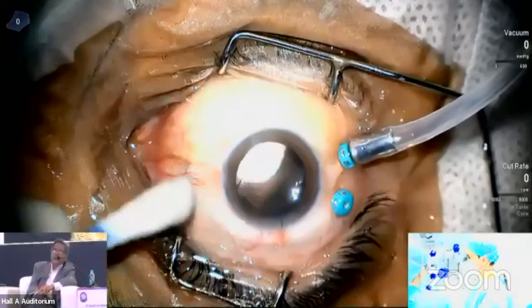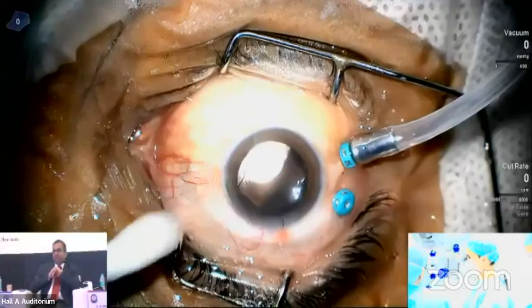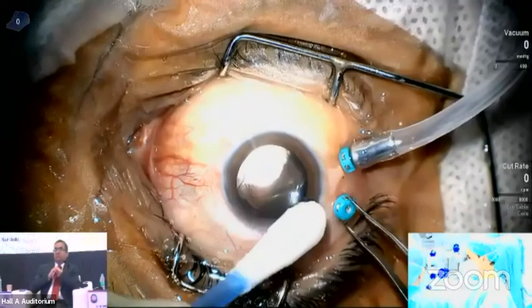So how are you ensuring this port is closed? Like you're trying to massage. What else do you do, let's say a resident is doing it, and it's still leaking? If it is leaking, you can see the air bubbles coming and you can check by putting air on the surface of it. You can see the bubble. Okay, you can go, inject.